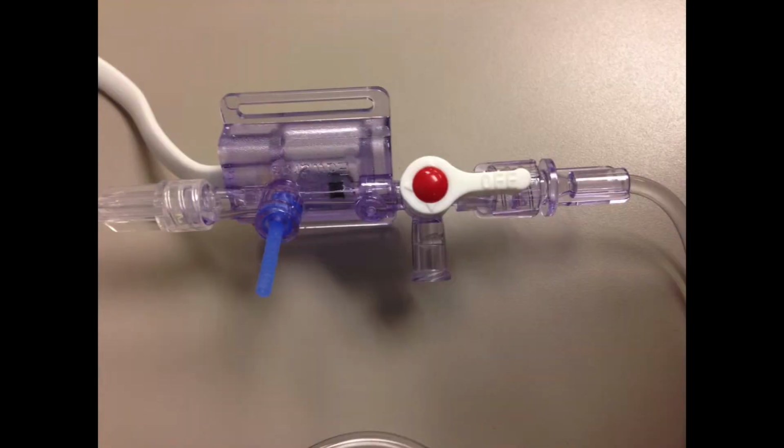So we want to make sure there are no air bubbles in the tubing or the transducer. The arterial waveform should be evident on the monitor. If it's not, we need to attempt a square wave flush test, of course. An overdamped system suggests air bubbles could be in the system and it's falsely lowering our pressure measurements.